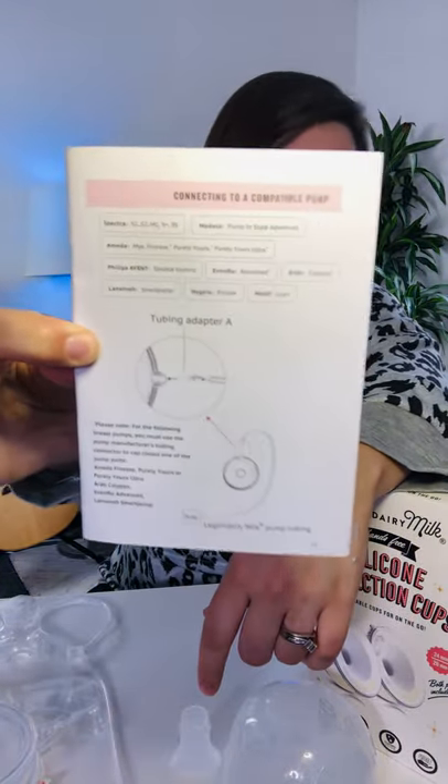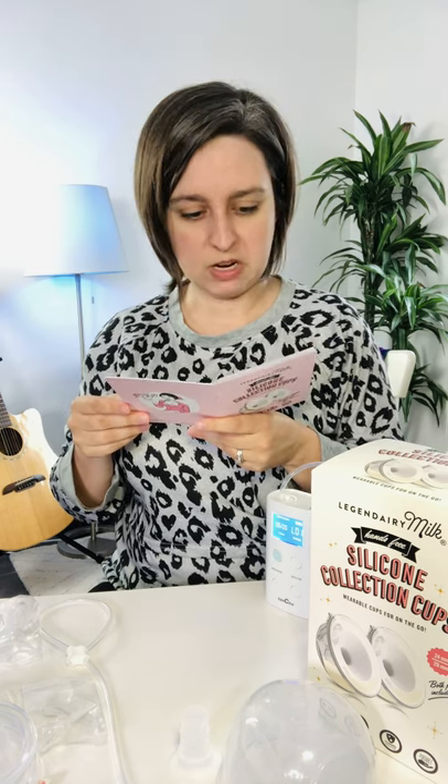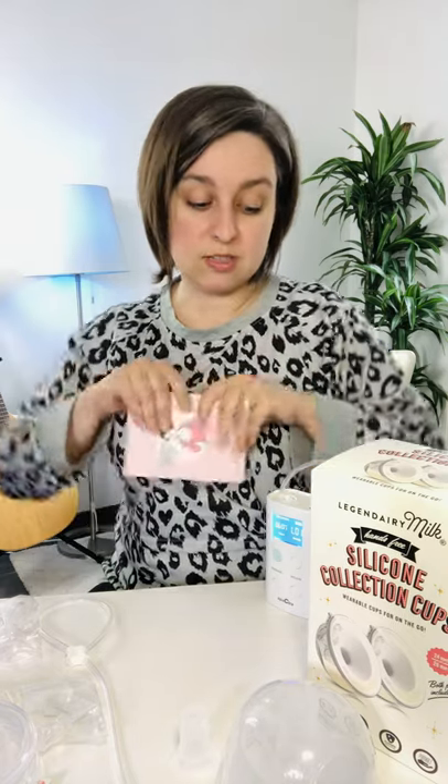All that information is in the manual for you. You can adapt this cup to a ton of different pumps. These are a closed system cup, so that means you can't hook them up with an open system pump.